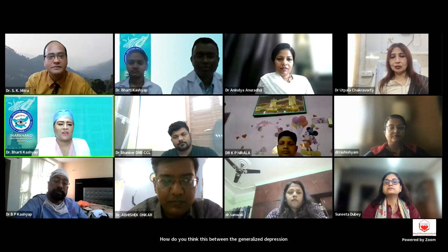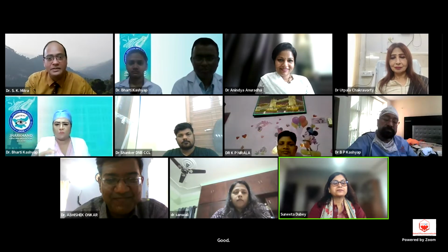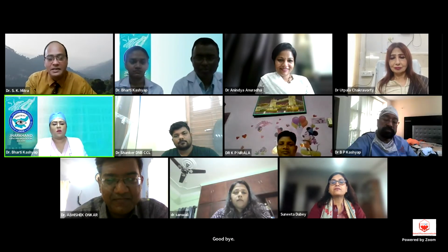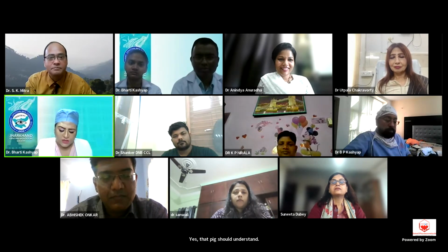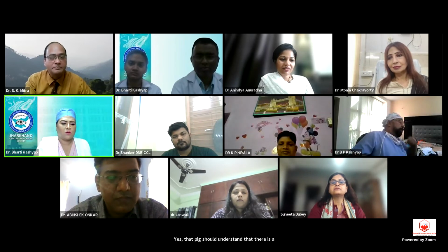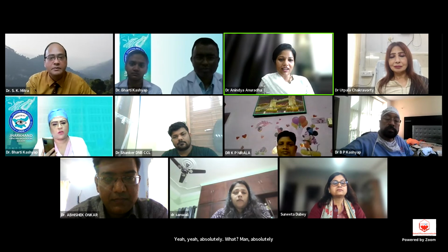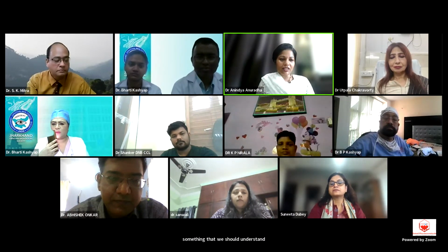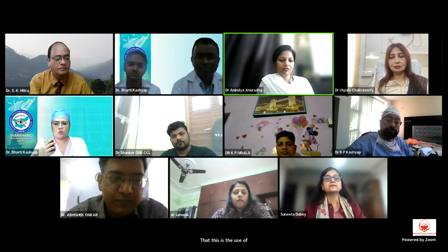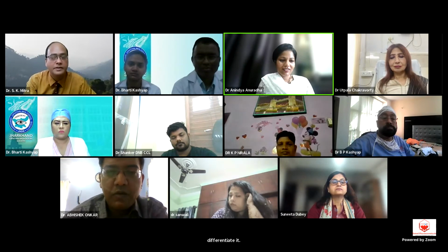That can be done with pattern deviation, by subtracting the pattern deviation from the total deviation. Yes, the PG should understand that. PG has to understand. Yeah, absolutely. What ma'am said is something the PG should understand: this is the use of pattern deviation, to differentiate whether it is due to glaucoma or due to cataract.